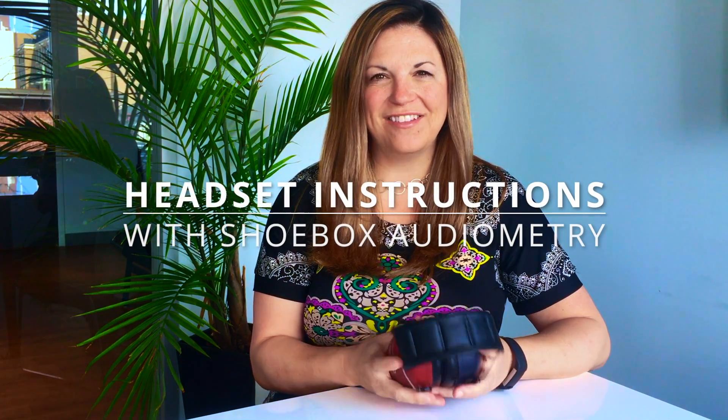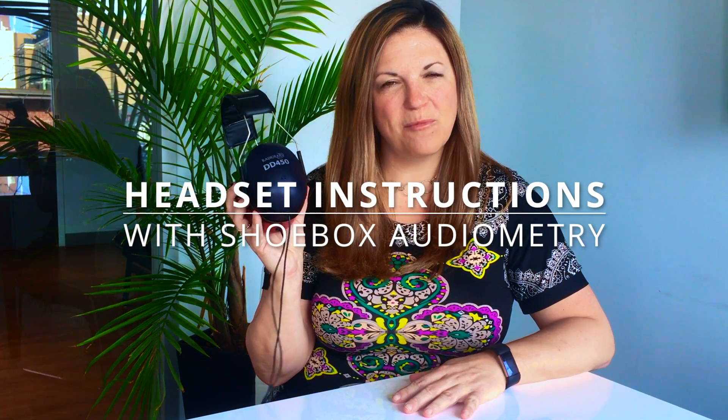Hello again, Renee LaFrancois from Shoebox Audiometry. Today we'd like to showcase a new headset, the DD450 from RadioEar. It was released in the latter half of 2017 and it is my preferred headset for several reasons.